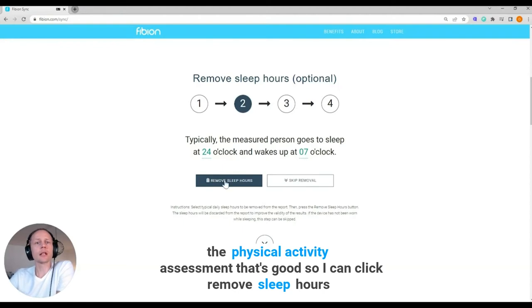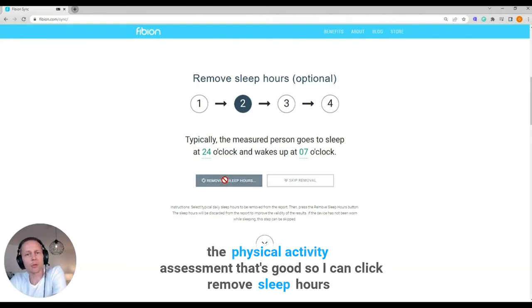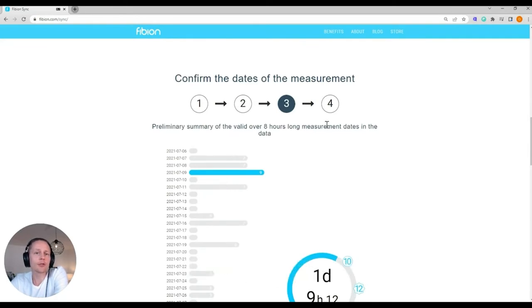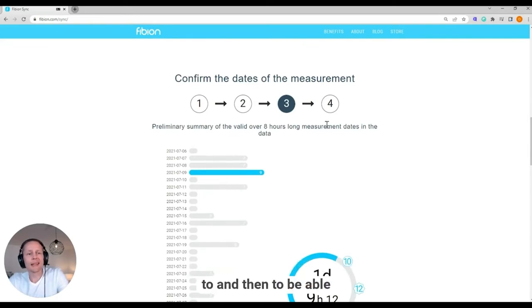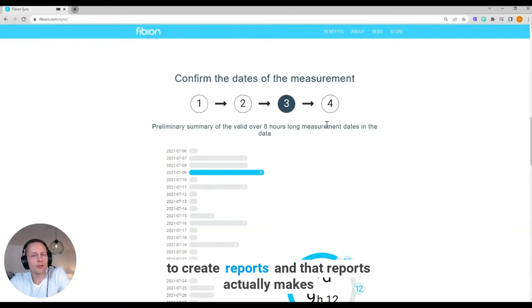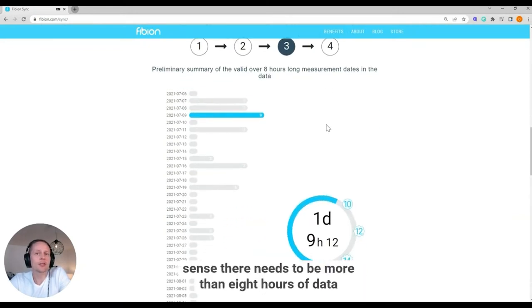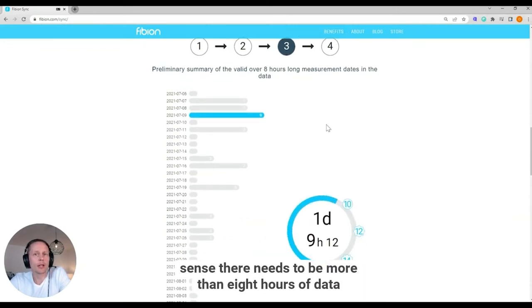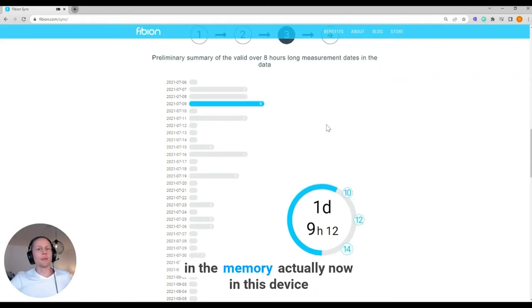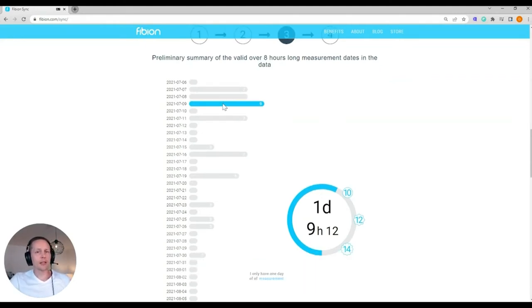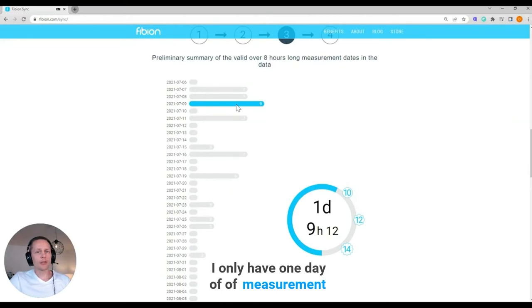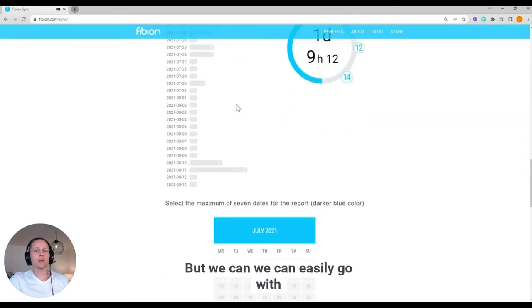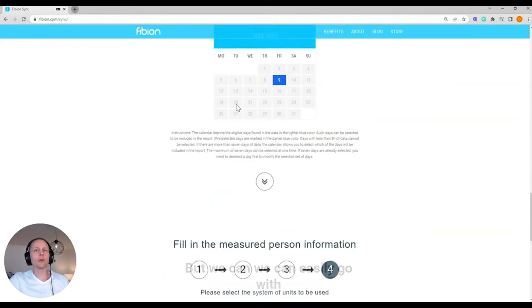So I can click remove sleep hours. I could also just click skip if I wanted to. And then to be able to create reports and that reports actually make sense, there needs to be more than 8 hours of data in the memory. Actually, now in this device I only have one day of measurement, but we can easily go with that.